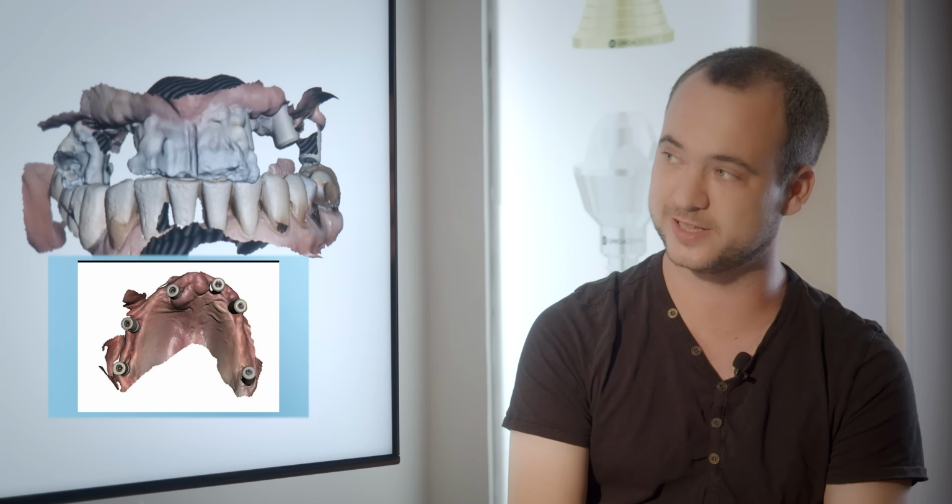In here, the composite is very thin. You just close the mouth on the composite, and that's all. You don't need to cover all of these abutments. You just need to have the relations, and using the abutments and the palatal areas, you can relate this impression to that one.